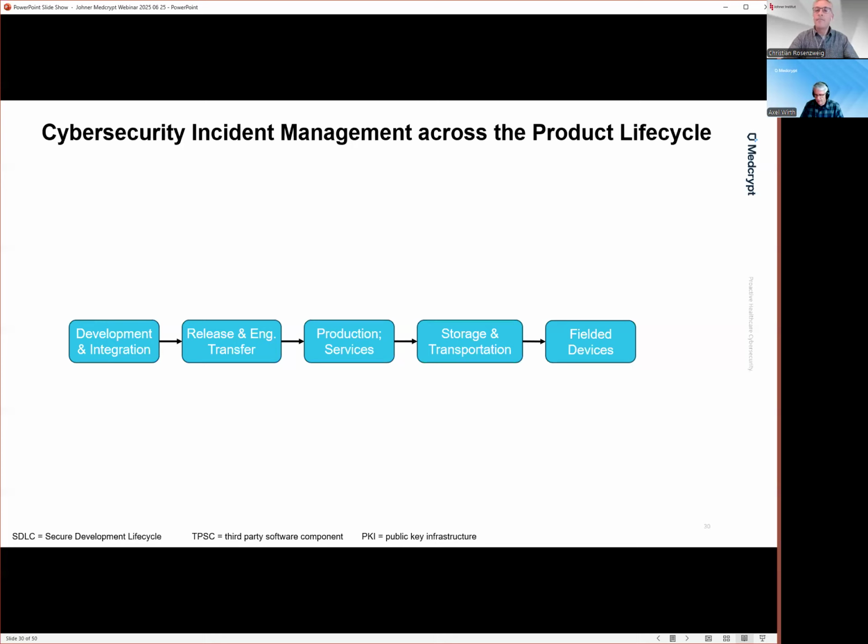And specifically, an area of special interest is your supply chain, right? Typically your engineers go through a formal process of approving supply chain components that get integrated in your product and are part of your overall testing. But you may also buy hardware components that contain firmware.